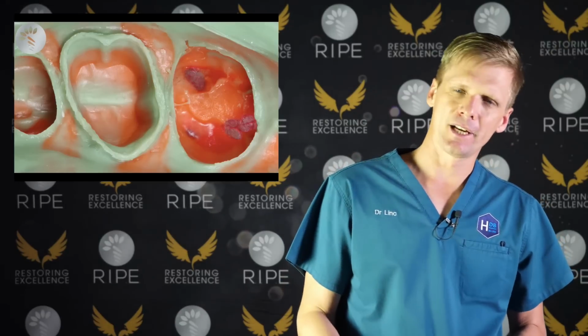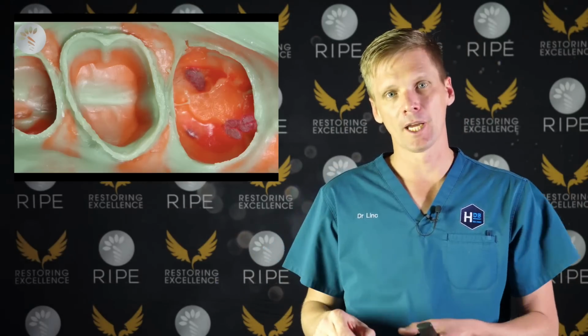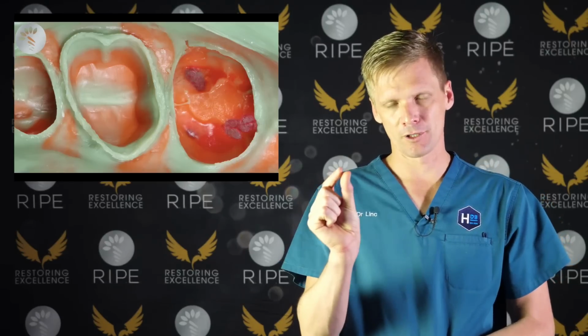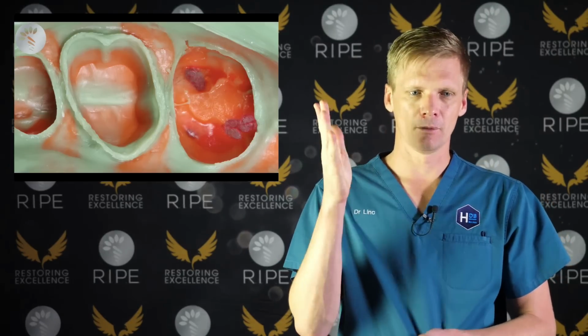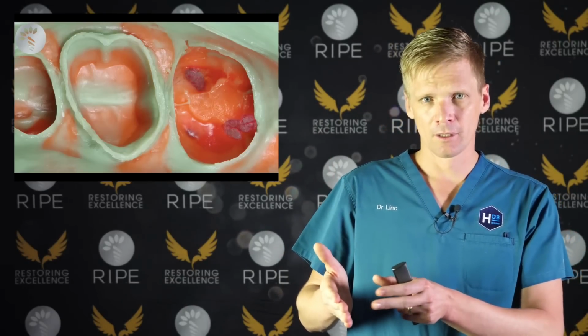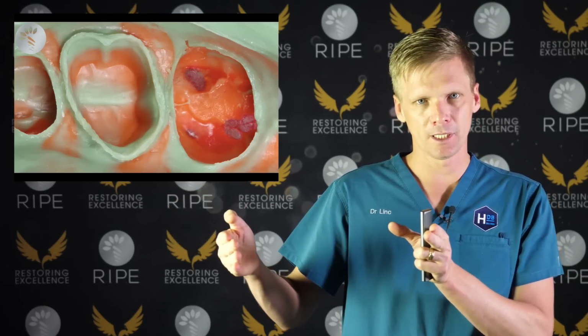Scanners can't see down inside implants. That's why you have to put a scan body on top. Scanners don't work down in deep, narrow holes, and silicone doesn't like to go down into deep, narrow areas either. It wants to get a bubble. So if you have a narrow sulcus, then you get a bubble. So now the trick to getting good retraction is you pack the thick cord and you pack it equal with the margin so that you displace the gingiva laterally.